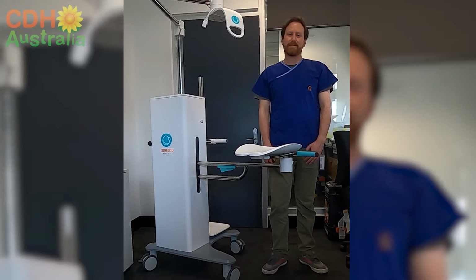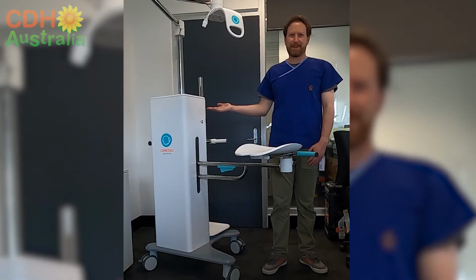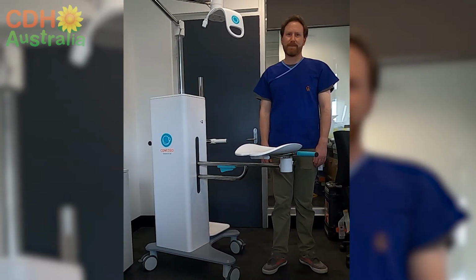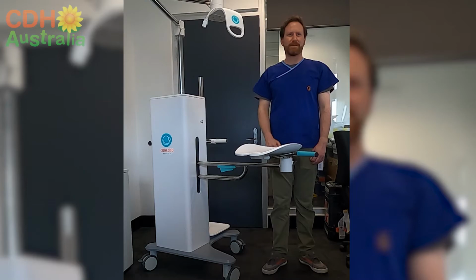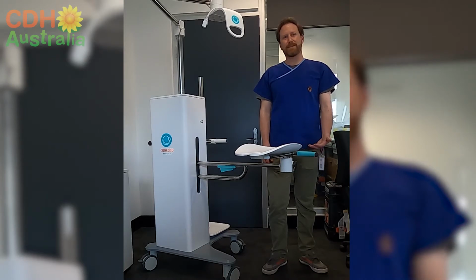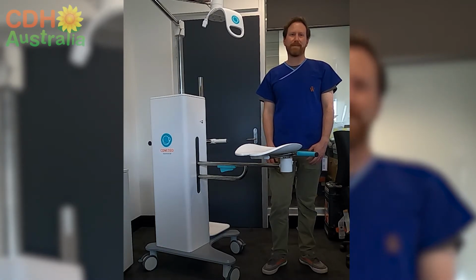Now, in order to do that, we need some equipment which will help to make that easier, and that's what you're looking at here today. This is called the Concord Trolley, and this trolley is something that we can wheel over and position directly over the mother as she's giving birth, and once the baby is born, they can be placed onto this platform here, where we, as a neonatal team of doctors and nurses, can provide the baby with all of the help they need in terms of breathing support while the umbilical cord is still attached and there's still blood flowing from the mother's placenta. Preclinical research done here at the Ritchie Centre suggests that this might actually help these babies and improve their outcomes.